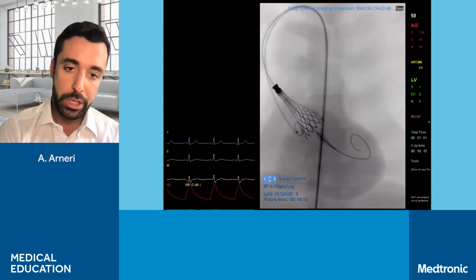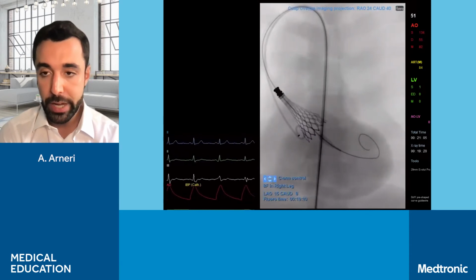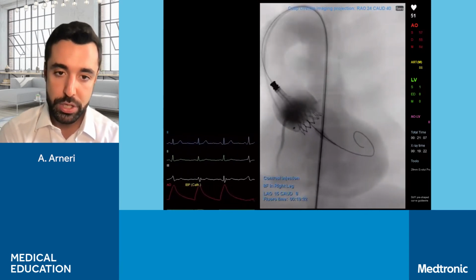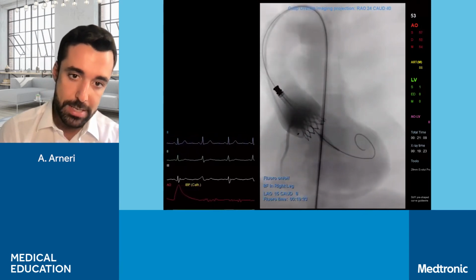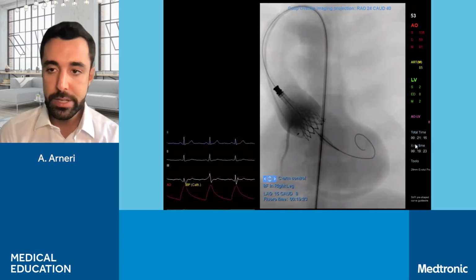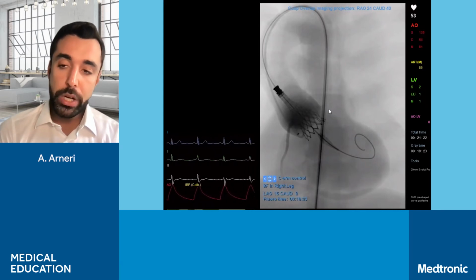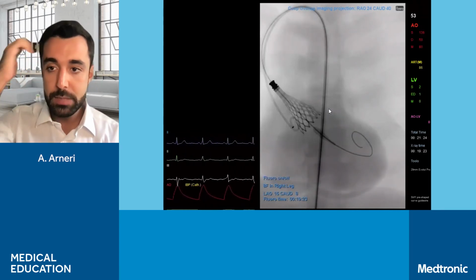So what we do here, we have to check how much is the implant depth below the left coronary cusp. So we do another contrast injection, and we need to assess if our valve is below the nadir of the left cusp. And also here we assess if the coronaries are perfused correctly. So everything is okay. And we are going to do our final release in this projection.